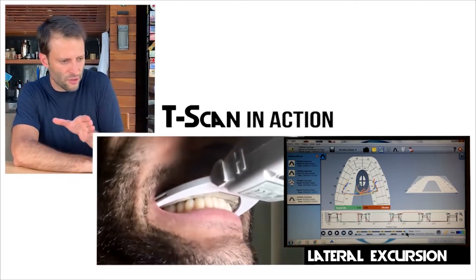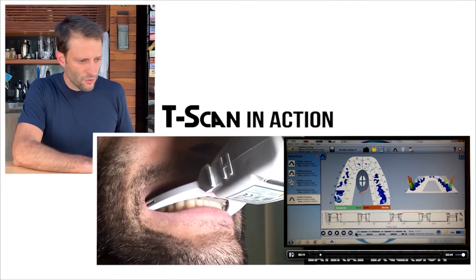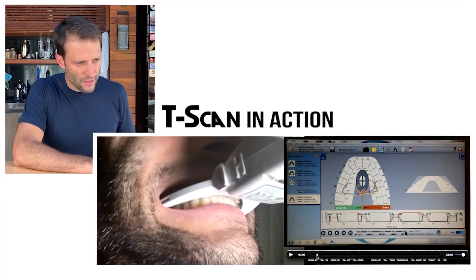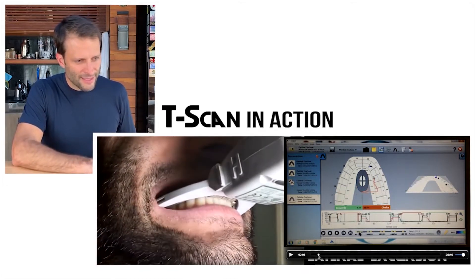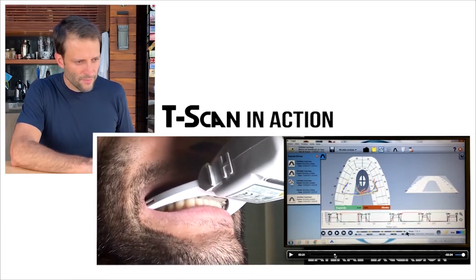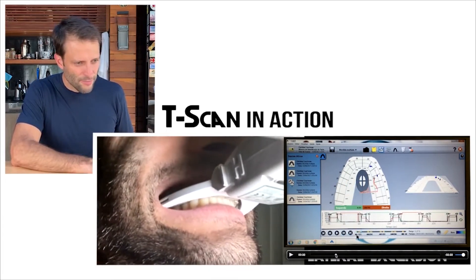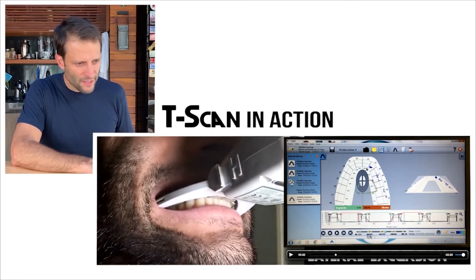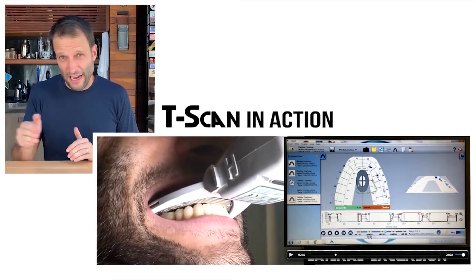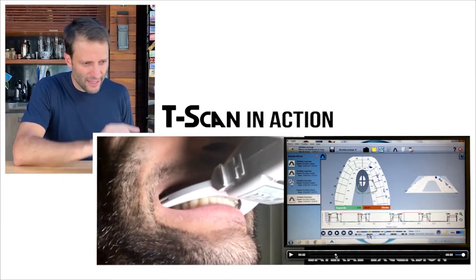Now let's see my lateral excursion. As I move to one side — I'm biting together with all the contacts and then sliding to the right — you can see I'm touching my lateral, not my canine. I know that because I don't have a canine guidance; I have a lateral guidance. It never gave me any problems, so that's why I never changed it, but I can identify it here easily.